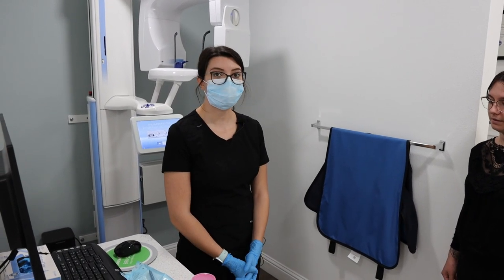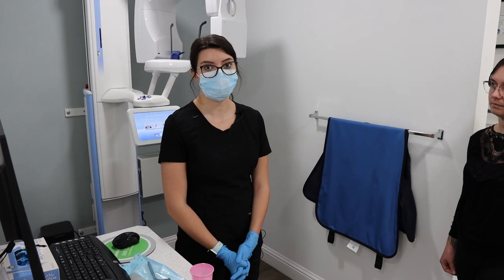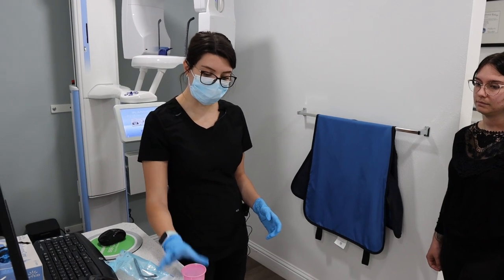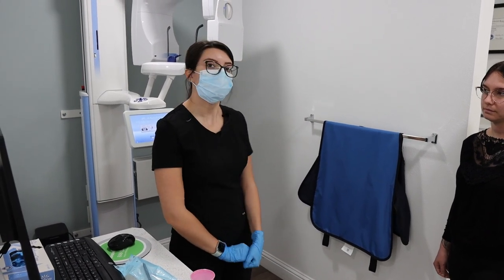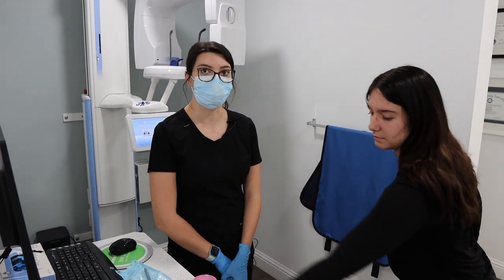Before taking a pano, you're going to instruct the patient to take off all jewelry, including earrings, facial earrings, and necklaces. You'll bring a cup for the patient to set all of that in. You'll also instruct the patient to take off any glasses or partials with metal in them.